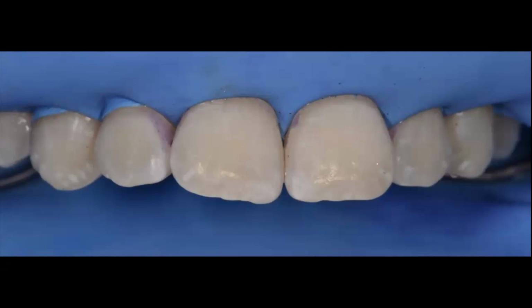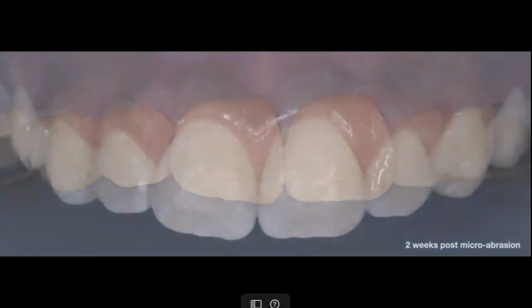And at the same time, you want to do mild on and off pressure because you don't want to create heat. Again, you don't want to create any sensitivity for the patient. So just mild pressure, I would say, on and off, 30 to 40 seconds per tooth. You rinse, you dry, you look at the tooth, and then you decide, is there a need for a second application? And again, normally there's a need for 2 to 3 applications. I have had cases maybe with 4 applications, but it all depends on the size of the lesion, on the depth of the lesion, and again on the sensitivity or no sensitivity of the patient.